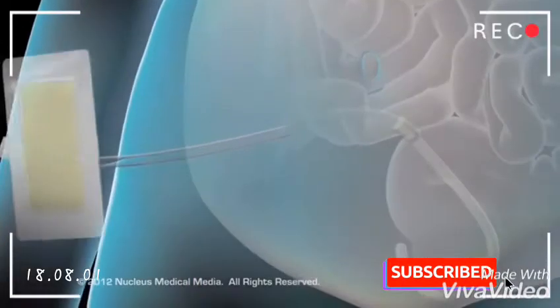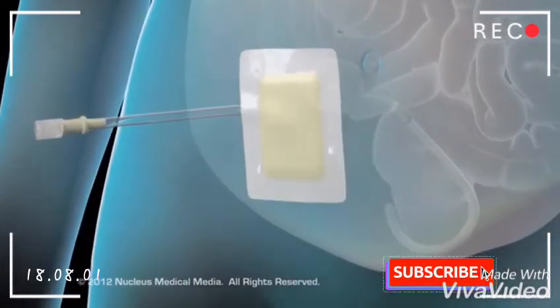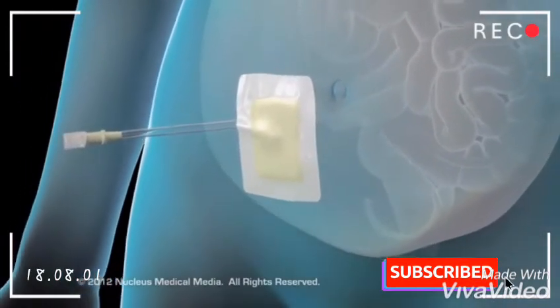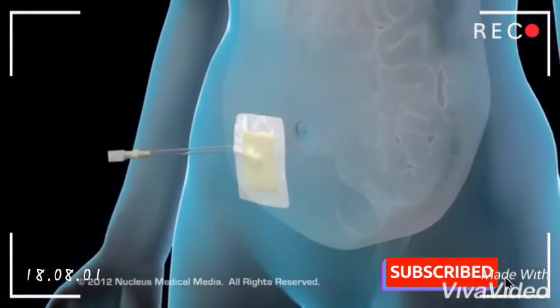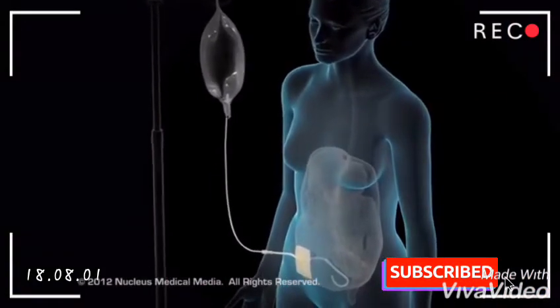During this procedure, the surgeon will set the catheter near the umbilical point, creating a passage through which the dialysate will enter and leave the abdomen.